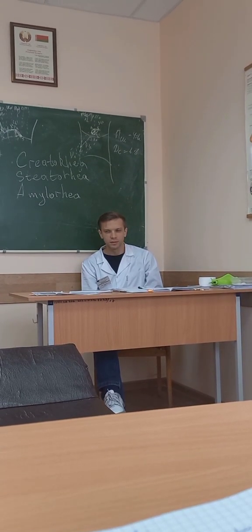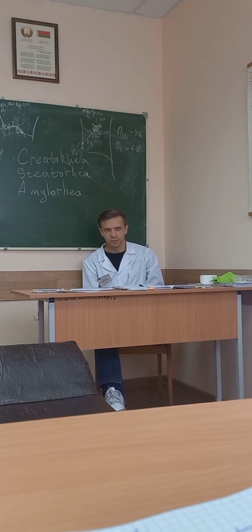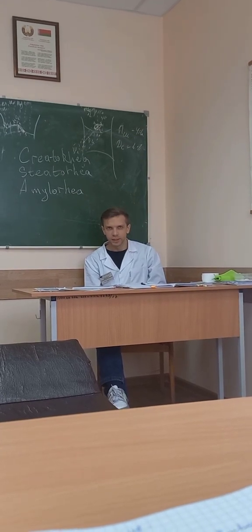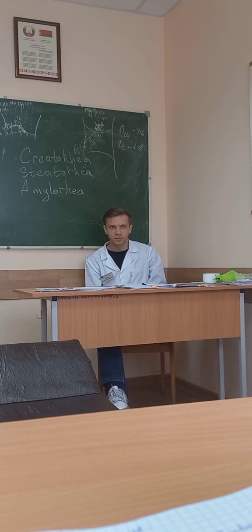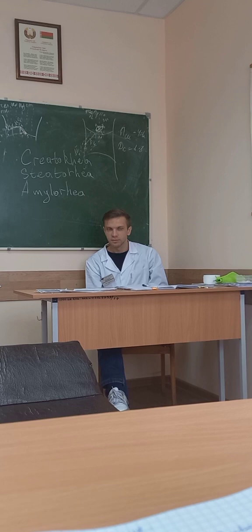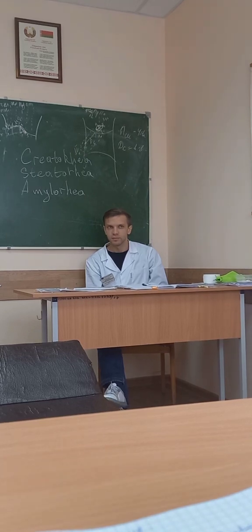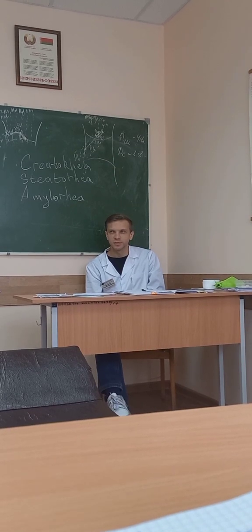What is the color? Brown color, normal, brown without anything more. So there is hidden blood and erythrocytes only, and no visible inclusions, there is nothing. We have to suspect cancer. Yes, because all is normal, but there is blood and erythrocytes, and we do not see the source of blood.